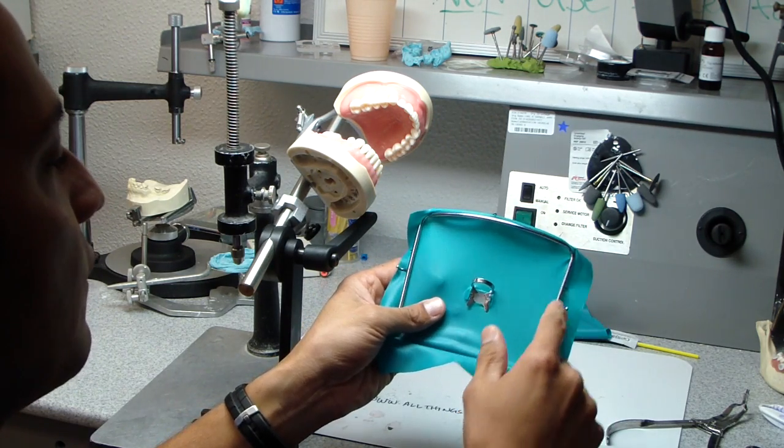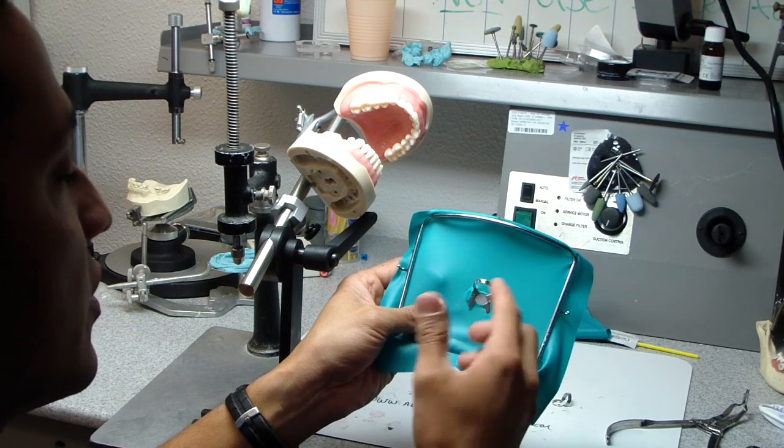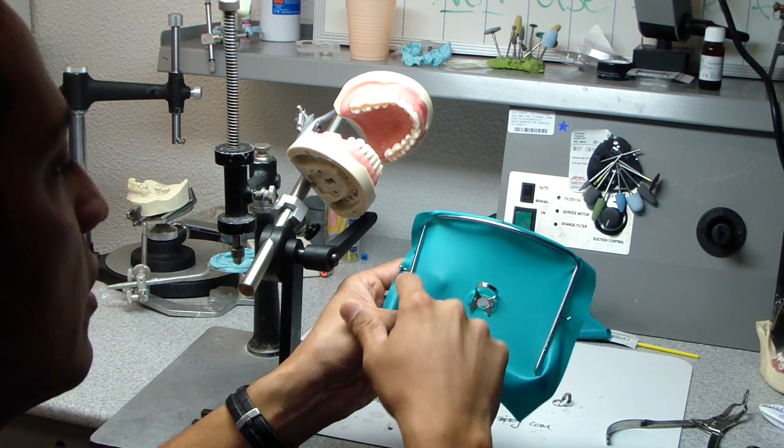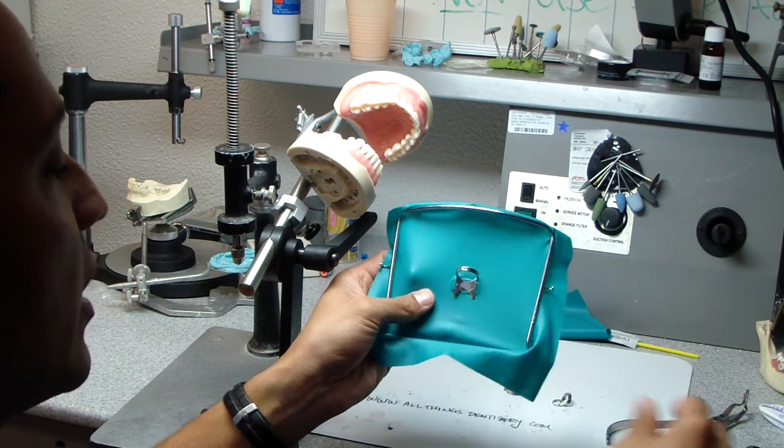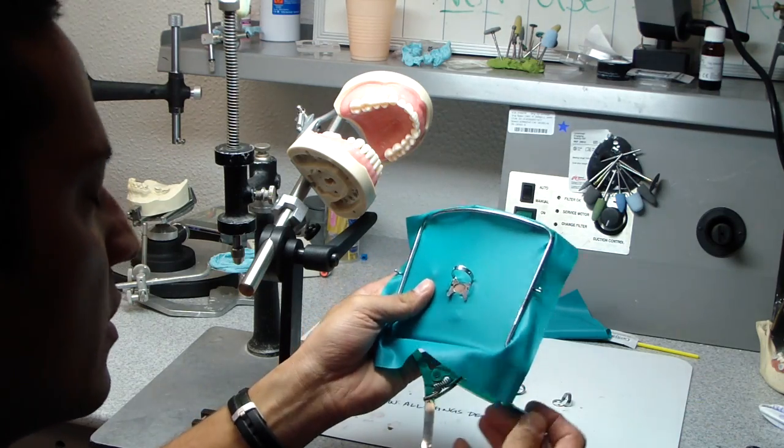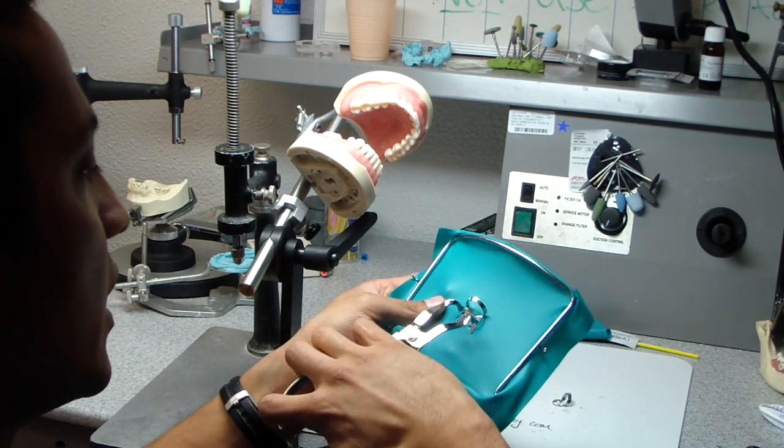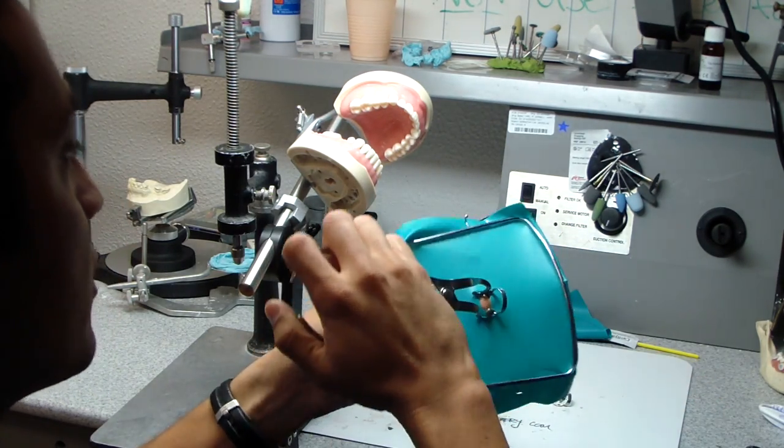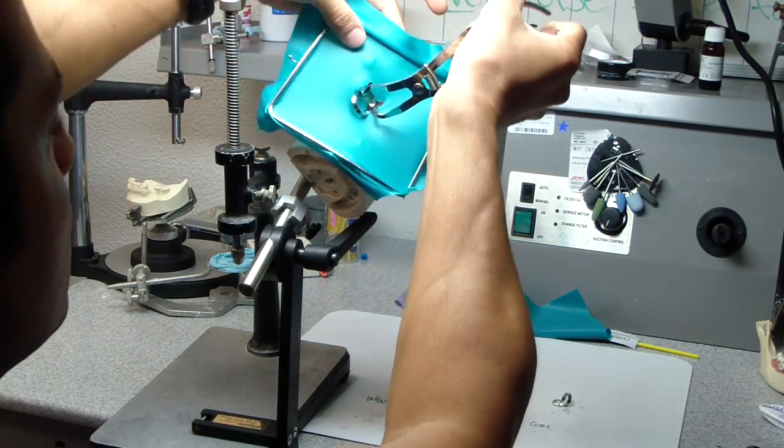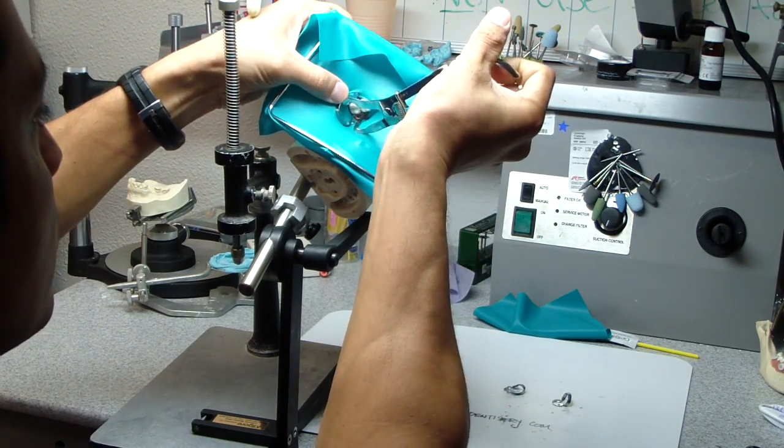I'm going to place the frame, the clamp, this is a wing clamp of course. This little rim here is the same as the rubber dam frame. It's the only way I can remember, ten years of doing dentistry. So we're going to place this all at the same time, we're going to go onto our tooth, posterior to whichever one we're restoring.